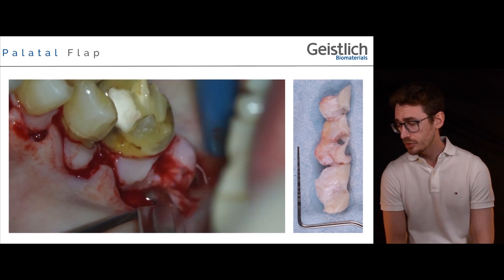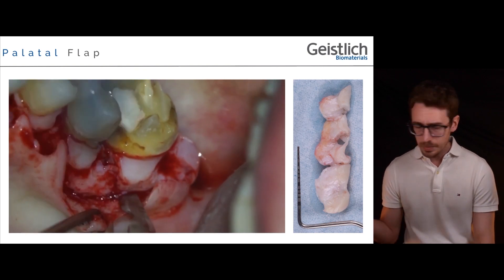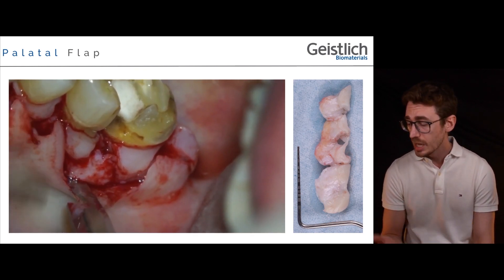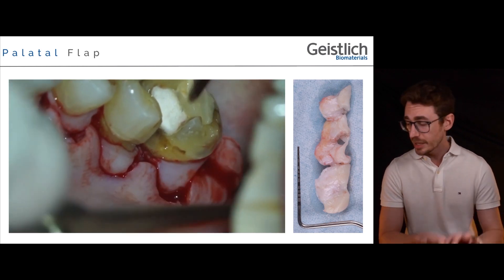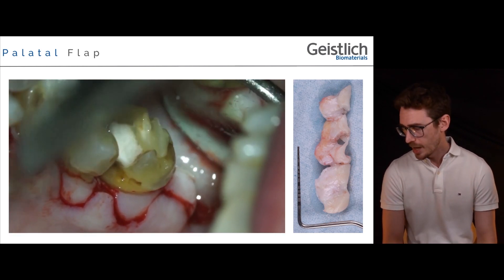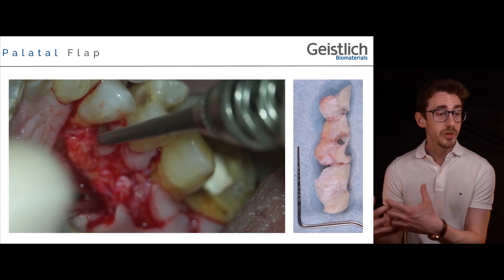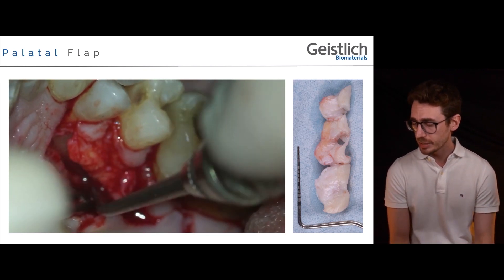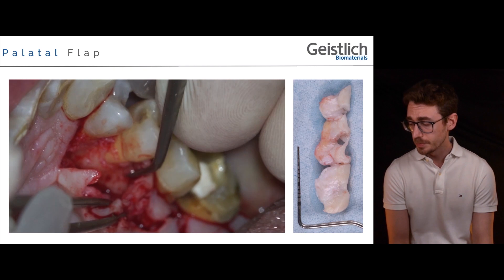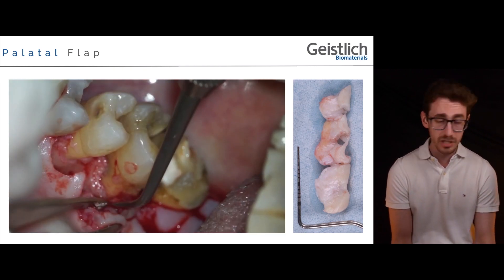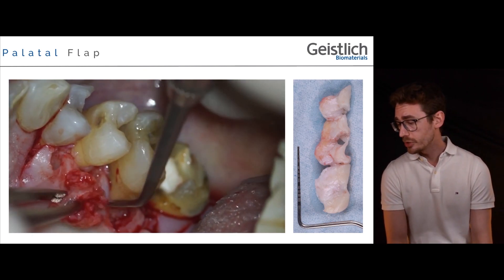We then move to a full-thickness incision, where the angulation of our blade shifts from parallel to the bone to perpendicular, and with this perpendicular incision moving from distal to mesial, we reach the premolar area to completely separate the primary thin palatal flap from a secondary deep full-thickness palatal flap. This secondary flap will be removed within the context of the resective procedure and the distal wedge operation. We then elevate the deep palatal flap full-thickness with a periosteal elevator or back-action chisel, removing all tissue in the cleanest possible way.